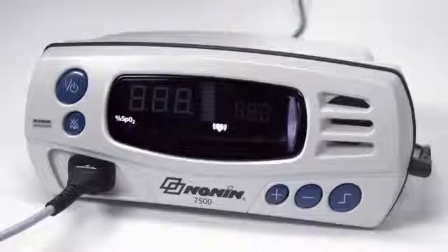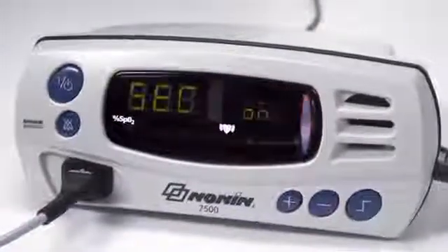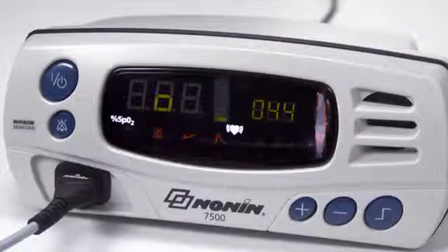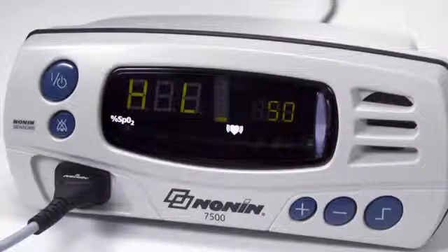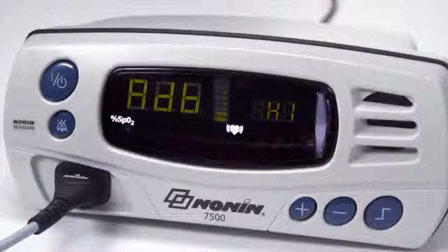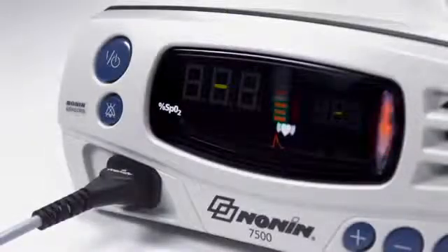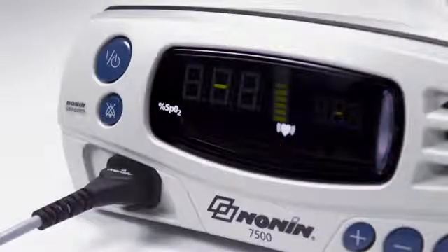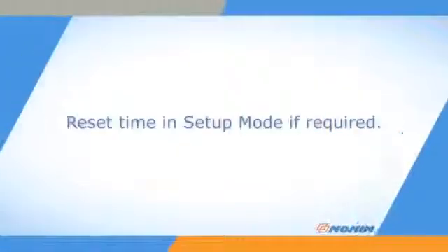The connector should firmly seat in the connector port on the oximeter. Press the ON-OFF button to start the unit. The oximeter will run through a power-up initialization as it turns on. Watch to ensure all LED elements and information appear as shown. If any LED elements or displays do not appear as expected, remove the unit from use and return it for service or repair. If alarms are enabled, they will remain silent for 2 minutes at startup to allow time for sensor placement or setting adjustment. Check the oximeter's time settings for accuracy during startup and reset in setup mode if they are not accurate or appear as zeros.